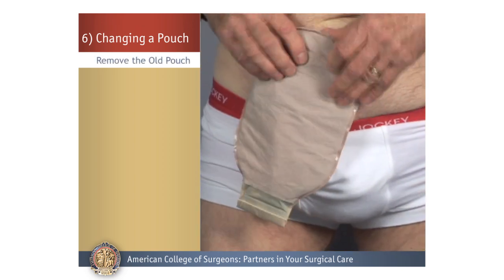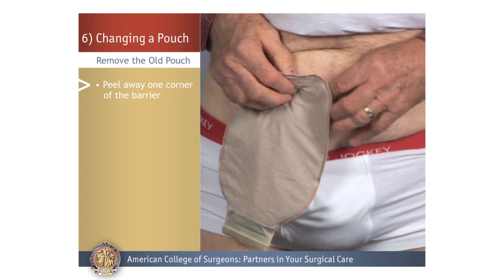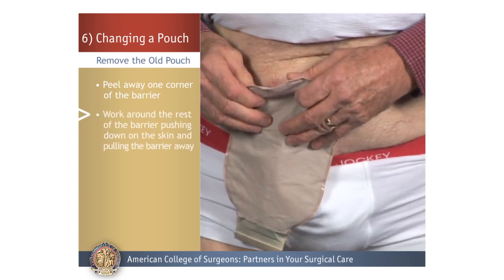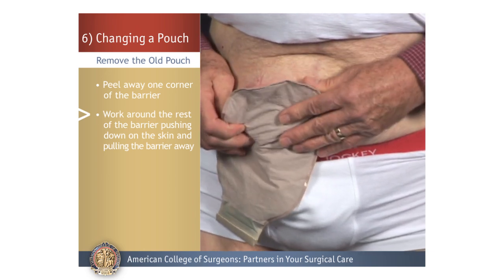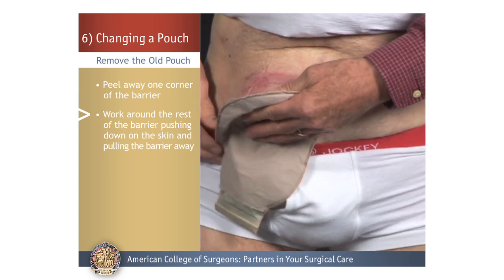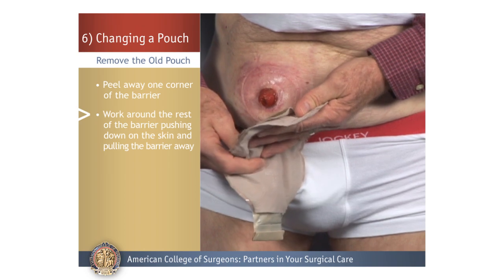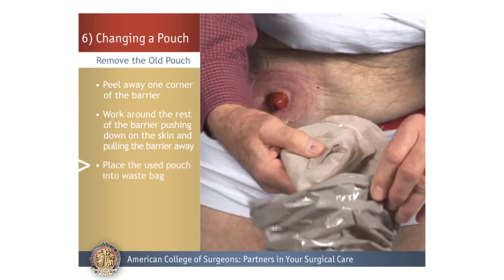Remove the Old Pouch: To remove the old pouch, begin by peeling away one corner of the barrier. Then work around the rest of the barrier, pushing down on the skin at each point while at the same time pulling the barrier away from the skin. Some people use a cloth or gauze to push on the adhesive as they remove the barrier. Lastly, place the used pouch into a disposable waste bag.